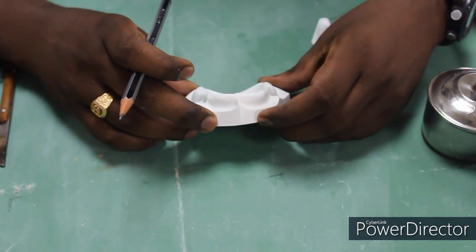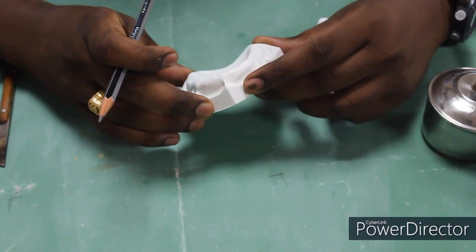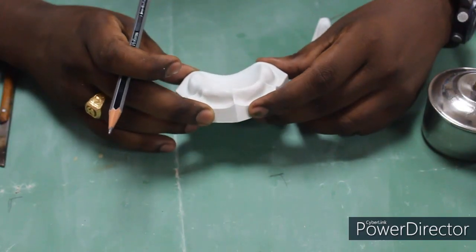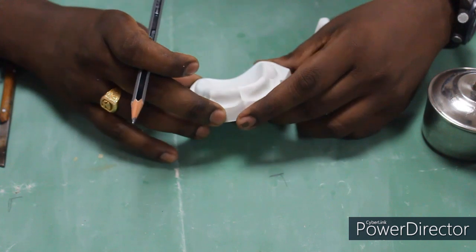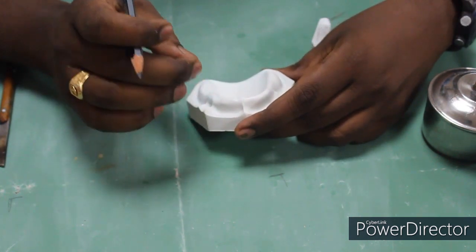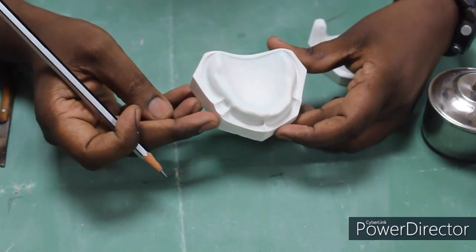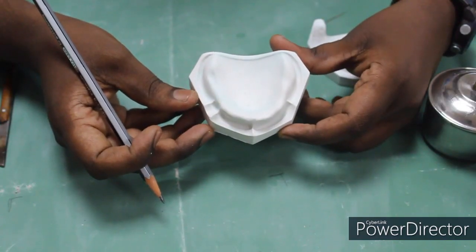To start the fabrication, first we have to draw the lines in the primary cast for adaptation of the wax spacer, followed by the fabrication of the special tray. What I am going to do now is use this Boucher's spacer design for the fabrication of the special tray. So this is the primary cast made from the diagnostic impression, that is the primary impression.